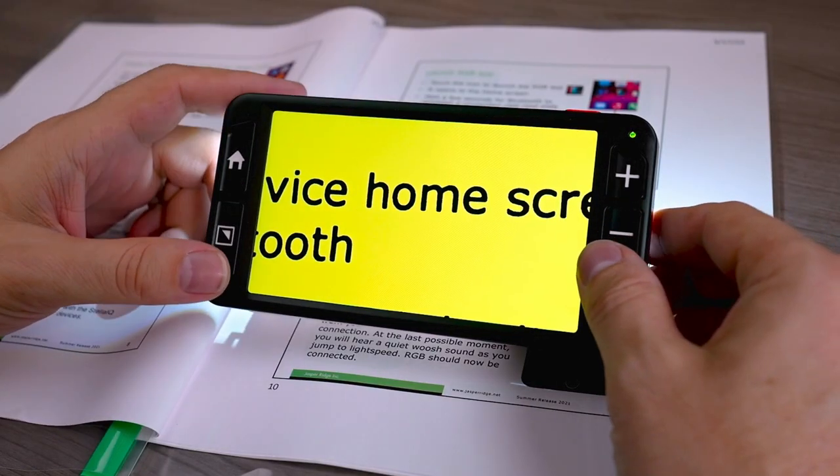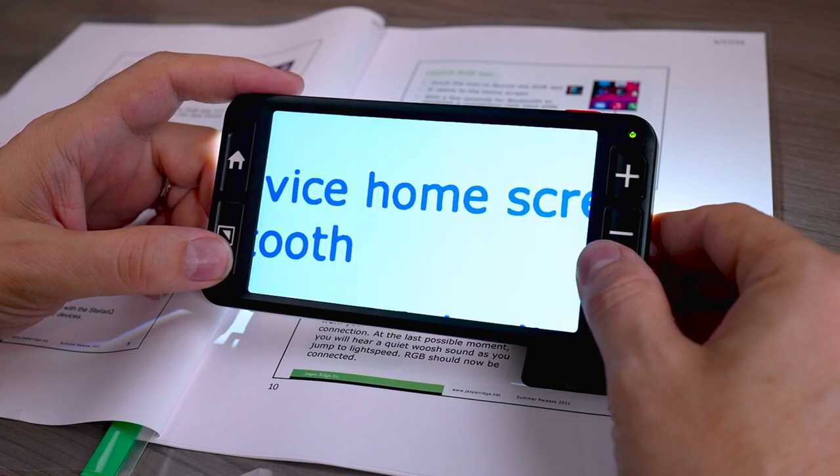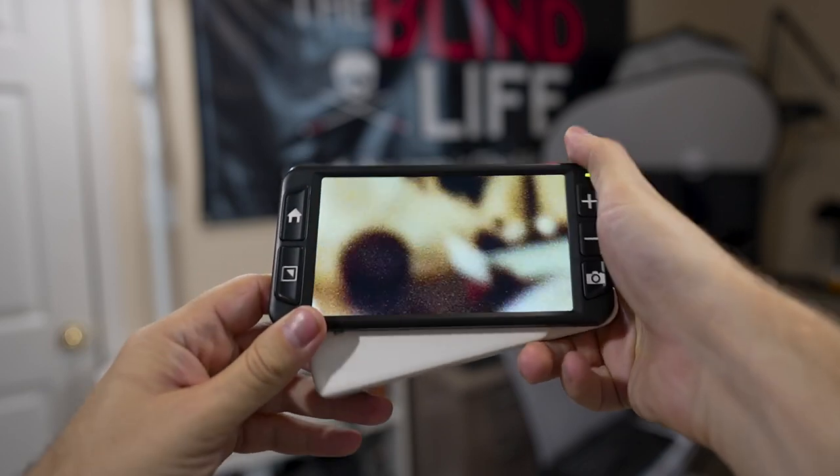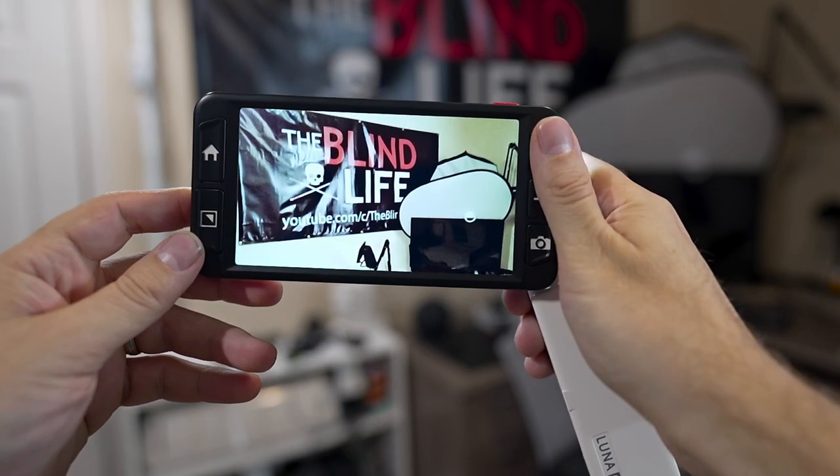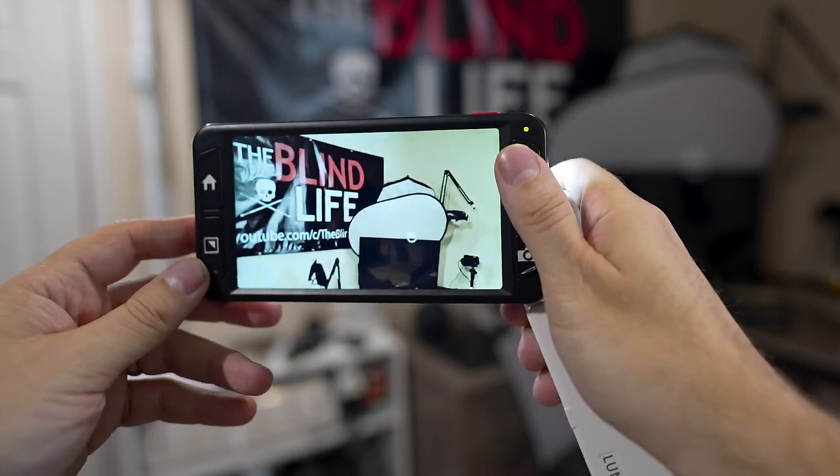On the left side there's a color button for changing color contrasts, with a pretty wide range to choose from — inverting, high contrast black and white, black on yellow, yellow on black. Above the color contrast button is a button with a little house icon; pressing it jumps you into the menu system, which we'll come back to. When you extend the handle, it switches from near viewing mode to distance viewing mode — indicated by a mountain icon — letting you see things far away. When you put the handle back in, it returns to near viewing mode for reading documents.